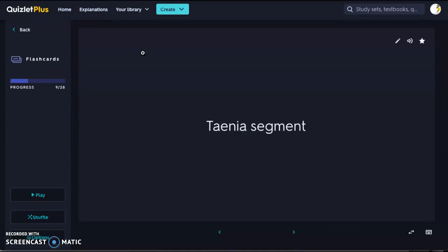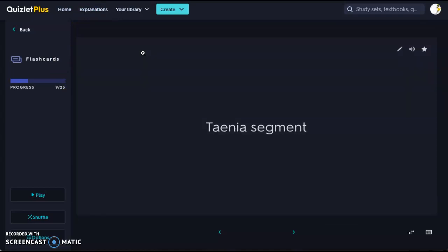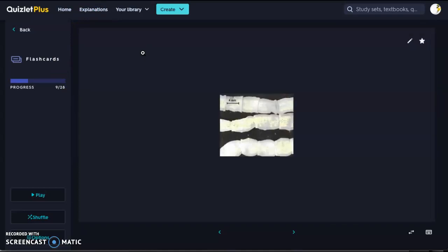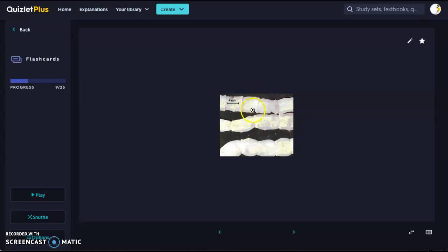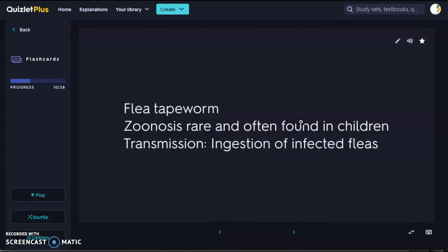Next we have the Taenia worm segment. Once it's an adult, it segments out. These segments are shorter and wider, which is going to be different than the next tapeworm species we're going to look at.